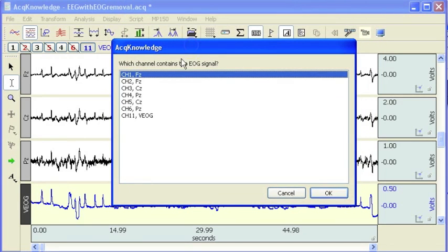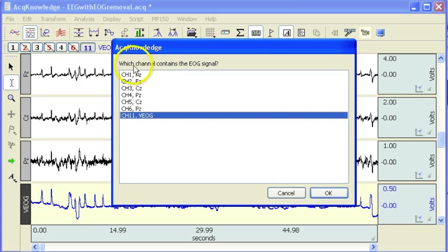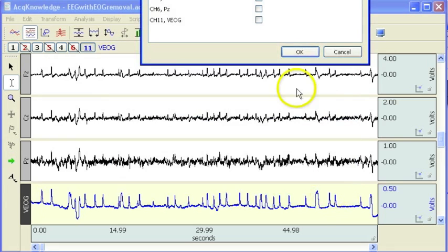A dialog box pops up, and the software wants to know which channel contains the EOG signal. In our file it's channel 11, VEOG, and you can see these are the channels that I duplicated: FZ, CZ, PZ, etc. I'm going to hit OK.